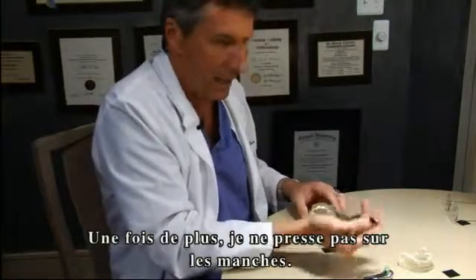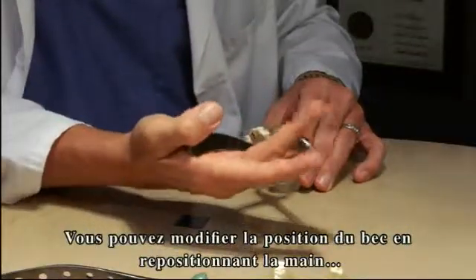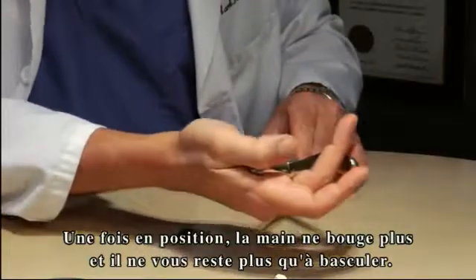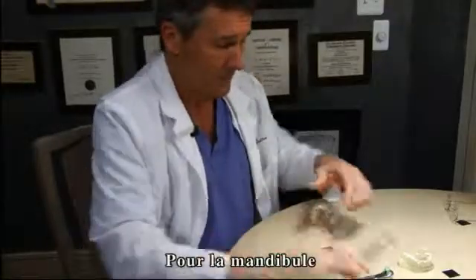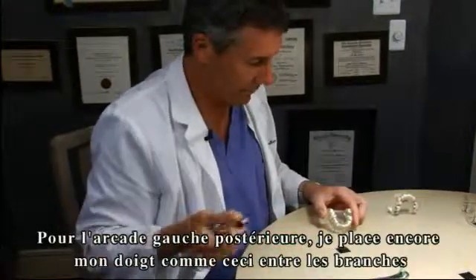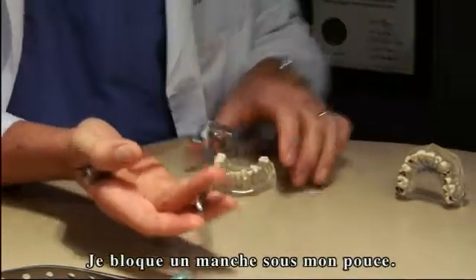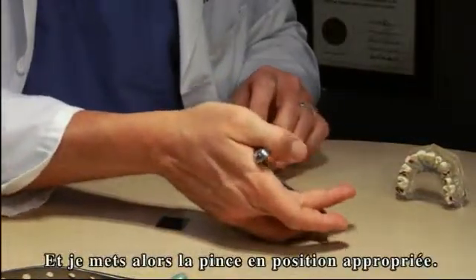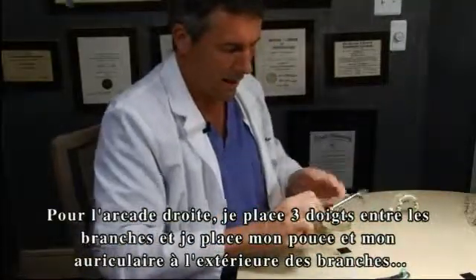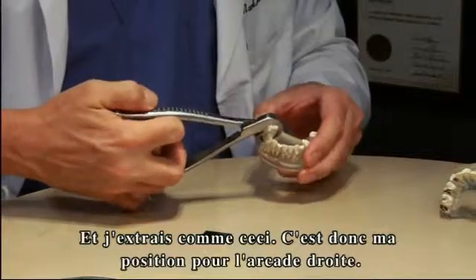Again, it's not squeezing — you've got to get past that. That's very difficult given our dental history, but you can vary the pivot point just by moving your hand. Once it's set, the hand position is fixed, and at that point you can provide delivery. For the lower arch, lower left posterior, I've got a finger positioned between the beaks — I'll lock one handle between my thumb, the other off to the side, then position accordingly. For the lower right, I put three fingers between the handles, hold it between my thumb and baby finger, and deliver this way.